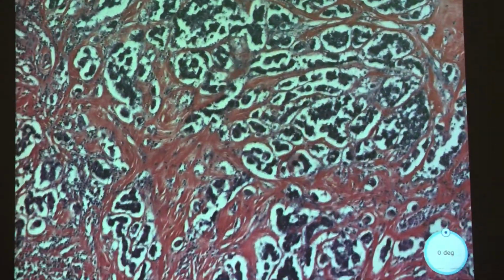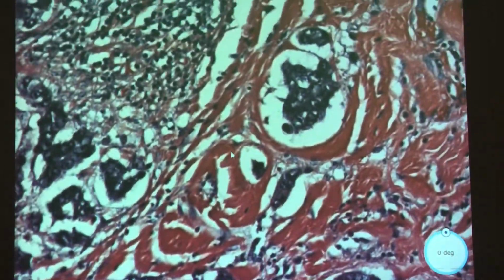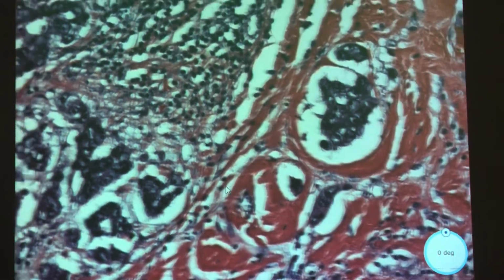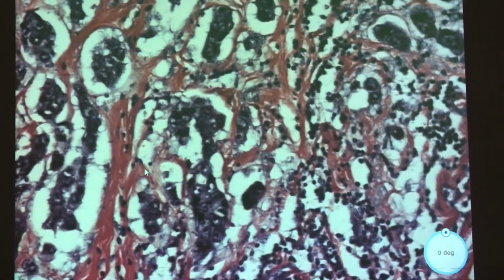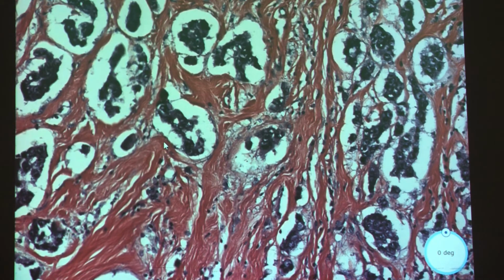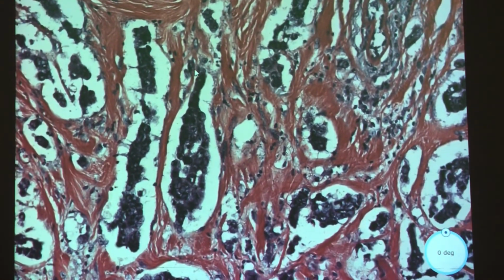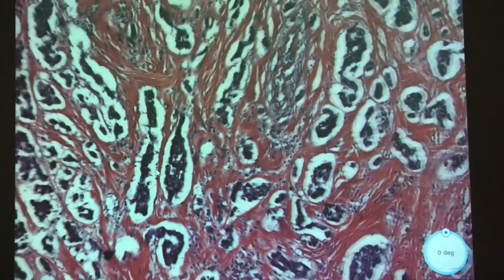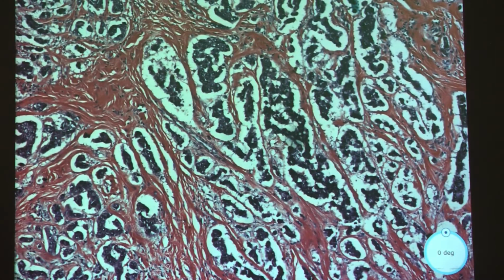So how would you tell if this is retraction artifact or real? If you know any tricks. If not, I'm happy to tell you. I would say I don't know any tricks off the top of my mind. I'm just thinking. Just maybe the lining. Tell me. Okay, so you had good ideas right from the get-go, and you kind of abandoned them a little bit.